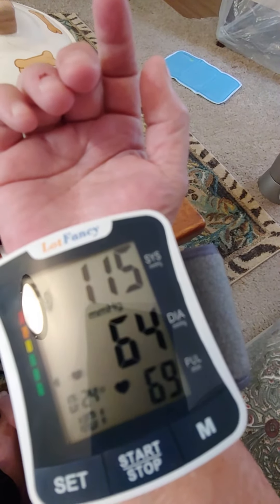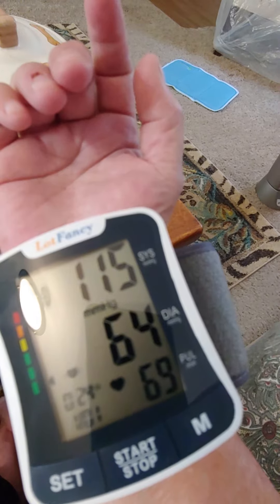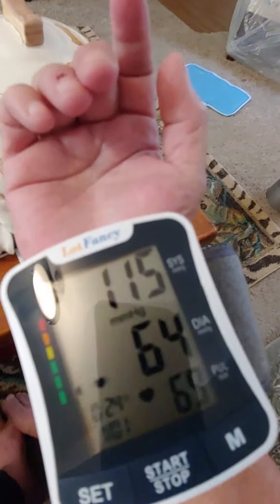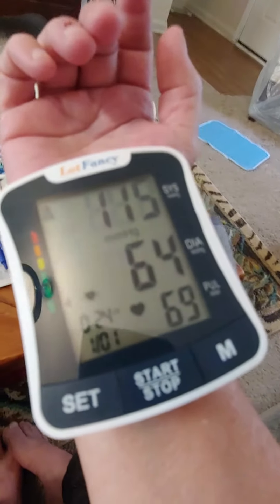According to WHO, these lines of blood pressure are optimal. A possible irregular heartbeat was found. Uh-oh — it said a possible irregular heartbeat was found? Is that what it just said? Holy cow.